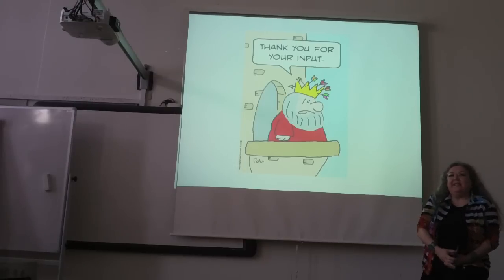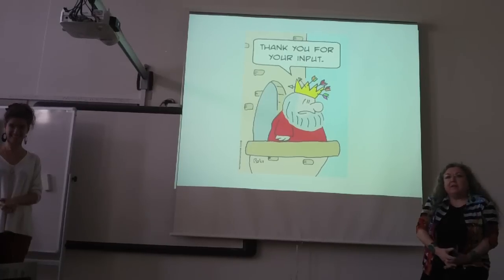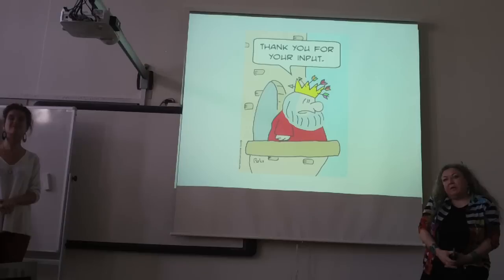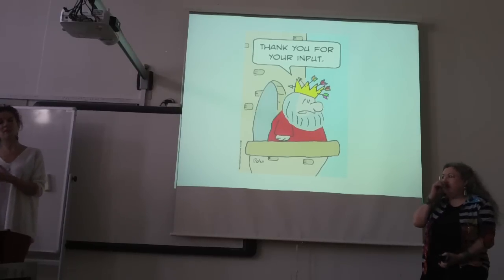Okay, we have the last question, Mila. It was just regarding, I had two actually, about the flageolet. When you tell the singers, just play around with flageolet, how would they describe flageolet? Is that in the way that we do today, with the description of just going for the hollow sound, or what did you do? Well, those singers played with the hollow sound and also with the high flageolet.